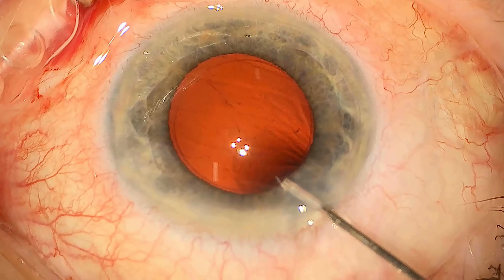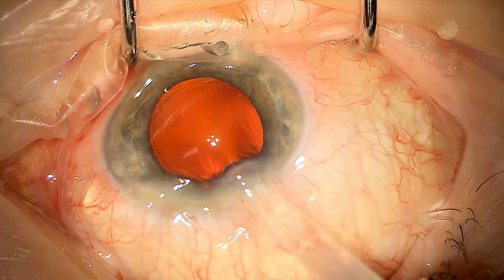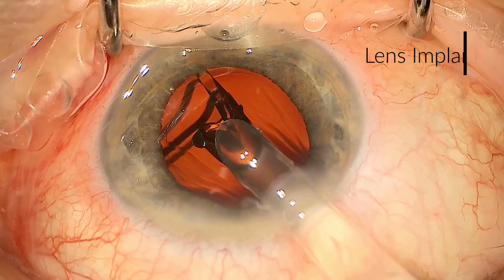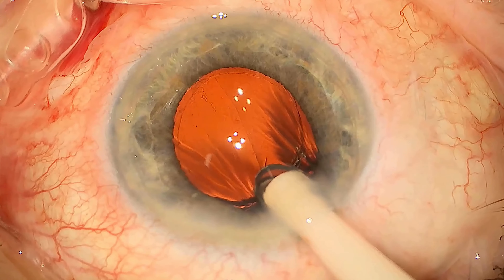We're inflating the bag with some viscoelastic. Now we're inserting the lens implant — this is folded in a lens injector and as we insert it into the bag it unravels itself, as you can see here. The measurements that we do before the operation allow us to calculate which lens to put into the eye.